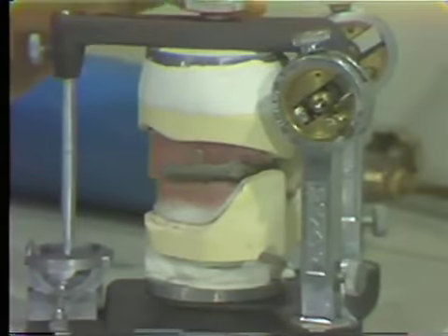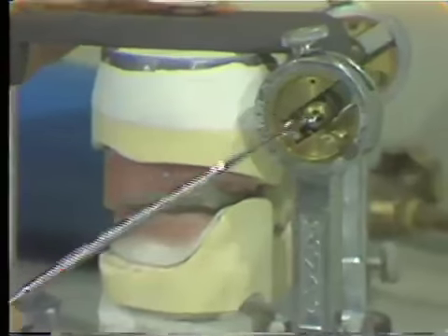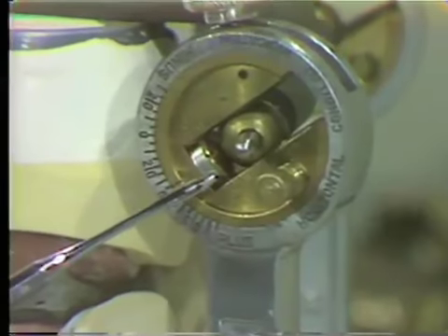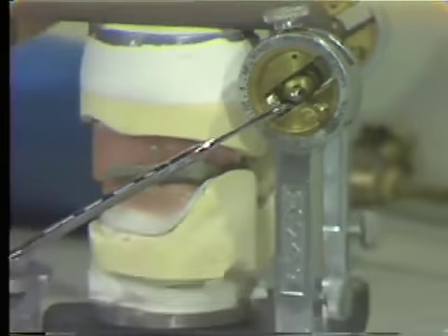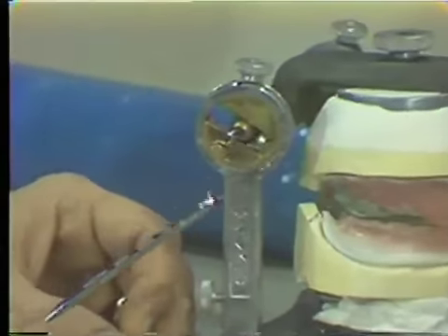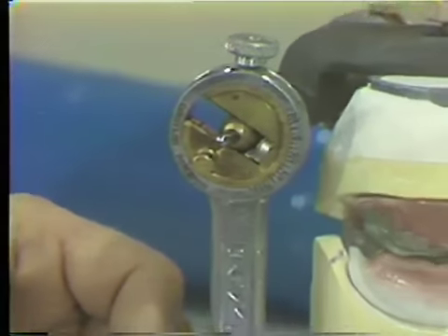The two wax rims are completely seated into the keys, and now we are going to check as to our condylar balls being forward and resting to our anterior stops. This is important that both sides are resting forward. In other words, we have recorded the same relationship as we had previously recorded. So we have verified our centric relation.